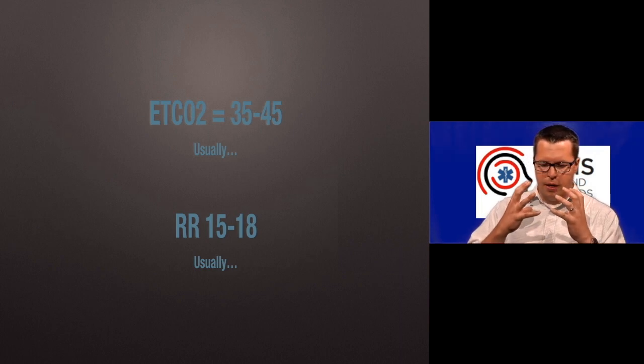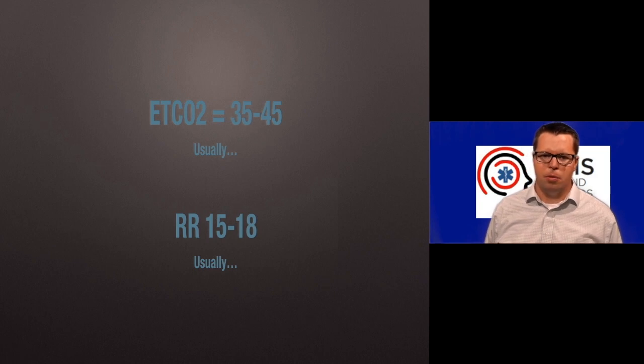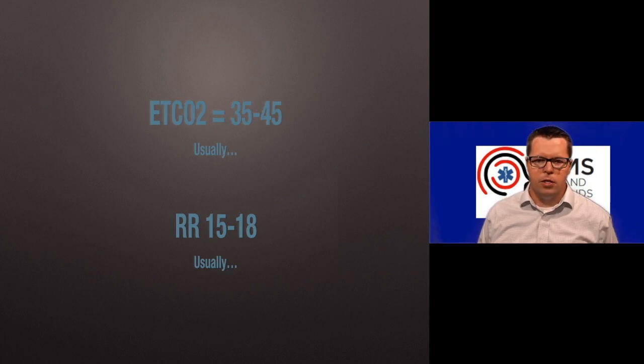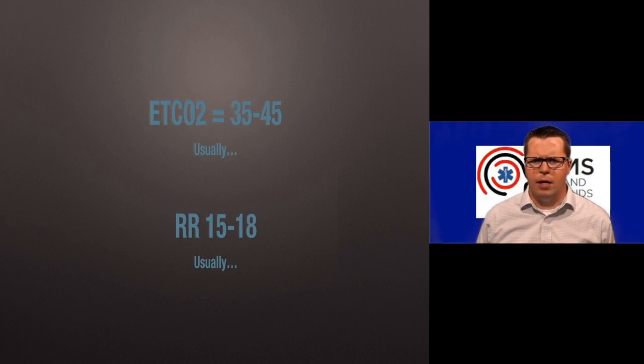Patients where you're just doing a face mask may need a little bit higher tidal volume because of the dead space, but for the most part, 15 to 18 breaths a minute. How do you get 15 to 18 breaths a minute? It's really hard, because none of us know. That's a breath every 4 seconds or just a shade under 4 seconds. What does that look like? Well, it's tough for us to tell, and most of us don't have a good handle on that.